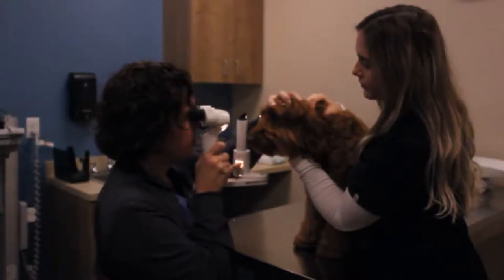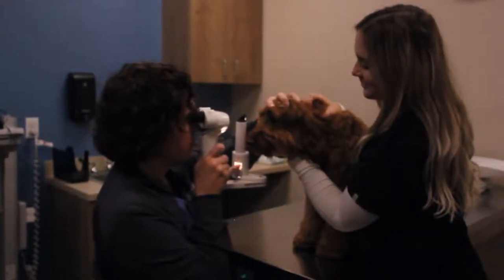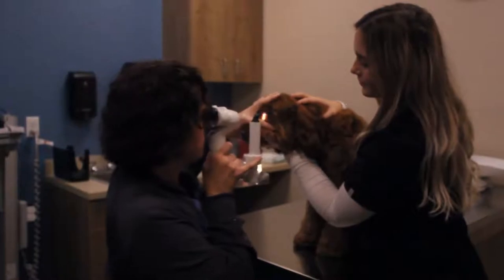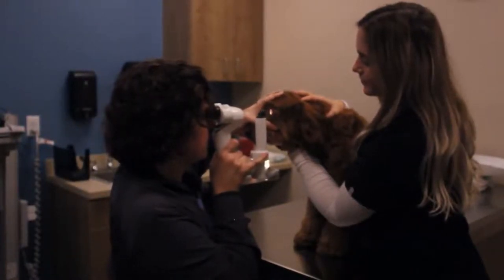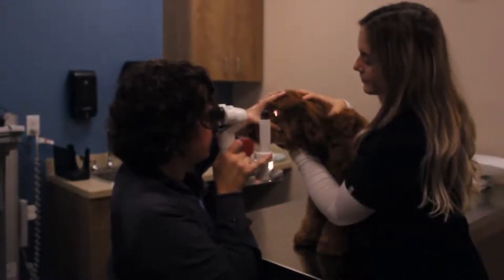This is not painful. They just have to hold still and that's what Miranda is for. We make sure we look at both eyes. This lets me look at the eyelids and the cornea, and lets me look at the lens for signs of cataract and all the detailed structures in the front of the eye.